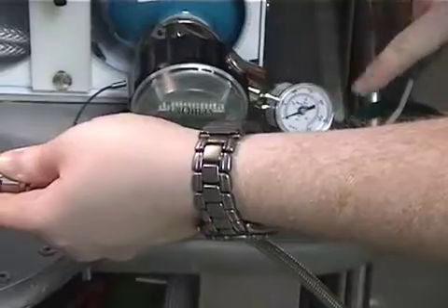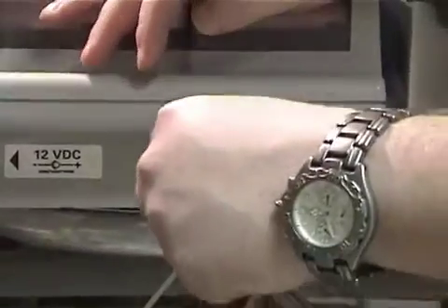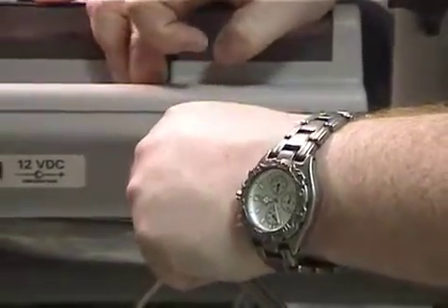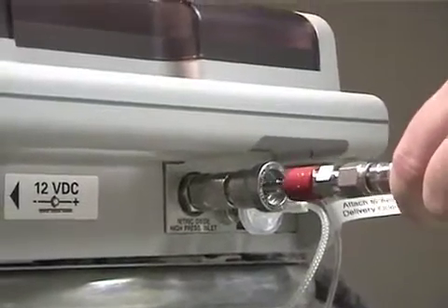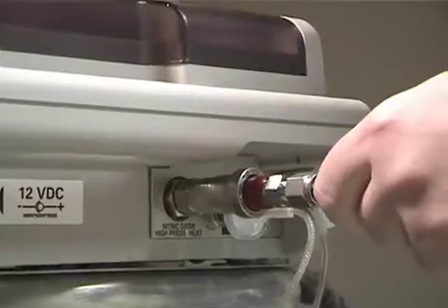When ready to deliver the nitric, you will connect the opposite end of the pressure hose into the Aeronauts connector. It snap connects the same way as it does with the pressure regulator.